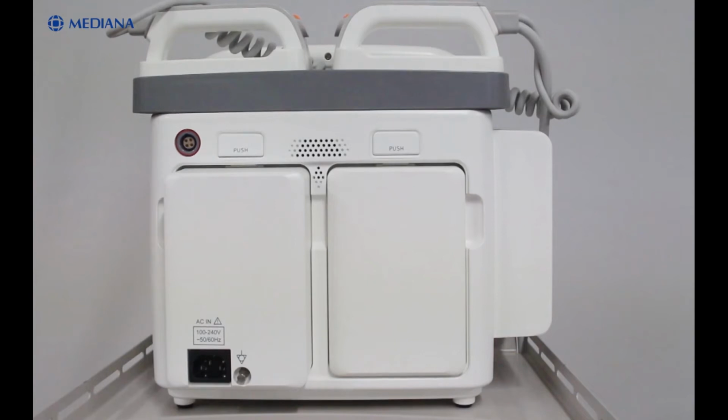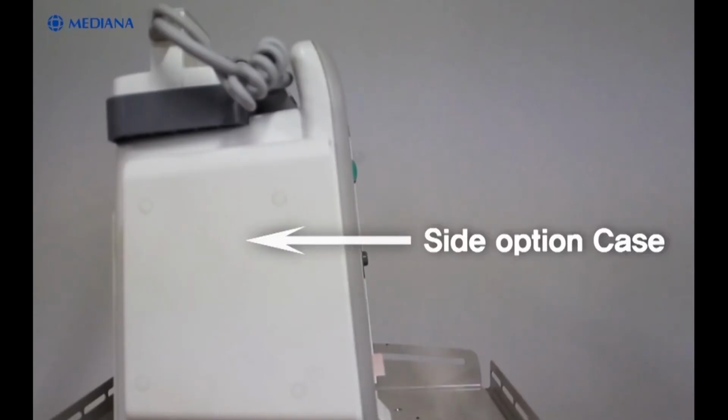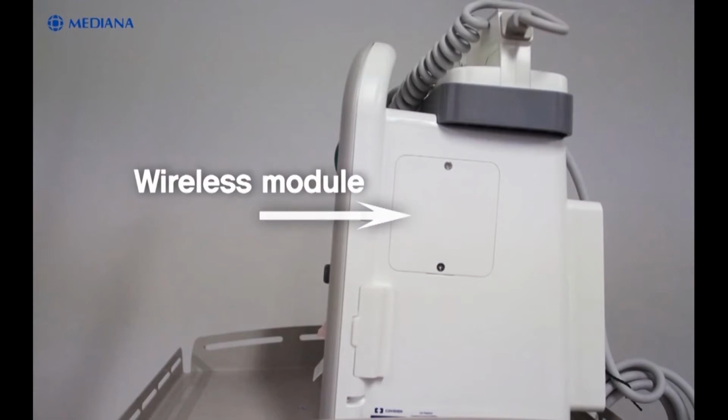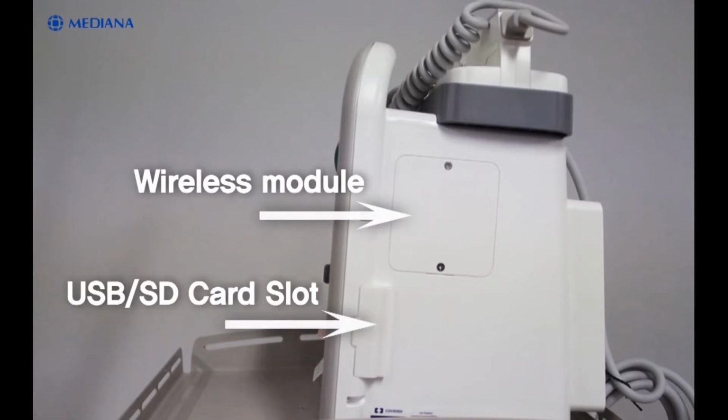Between 2 battery slots, we also have a speaker, so you can hear a prompt, DC input connector, ground terminal, and AC power inlet. For the additional components, you can see the side option case to the right, and to the left, we can integrate Wi-Fi or 3G module and USB slot, so we can upgrade the unit, and finally, the SD card slot for data transfer.